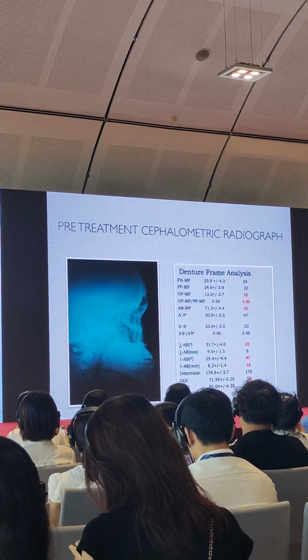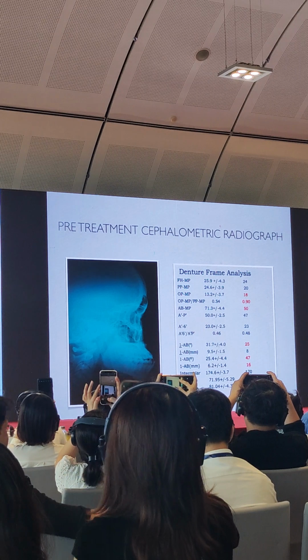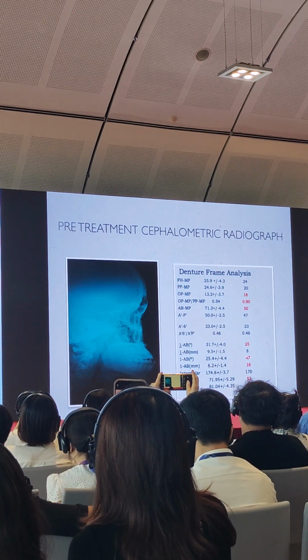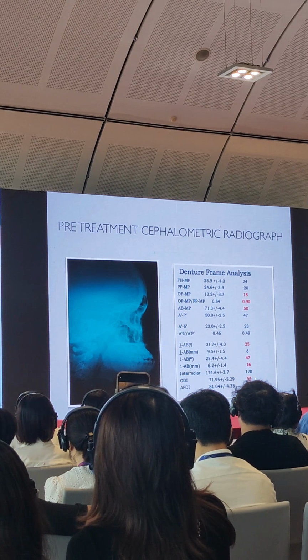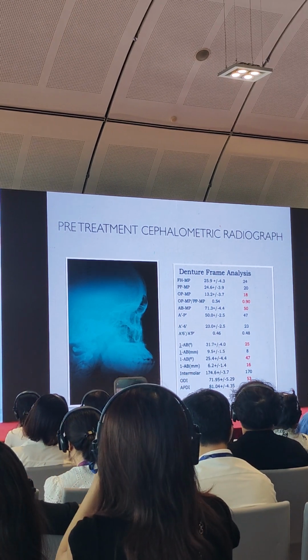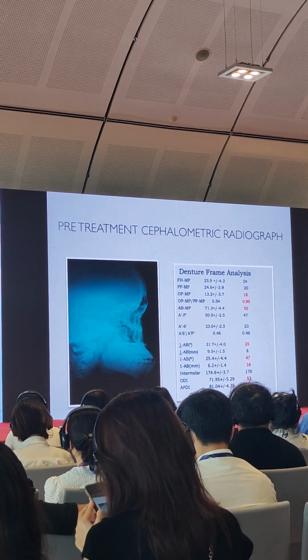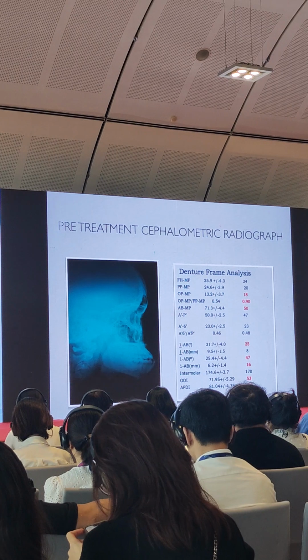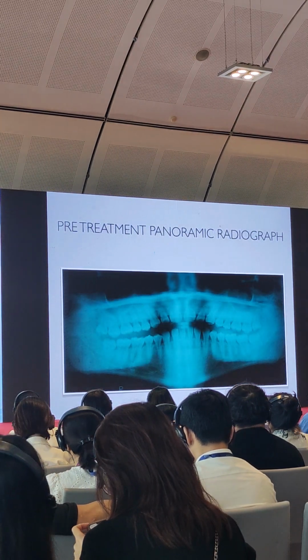Cephalometric would show you a very flat occlusal plane. The teeth on the upper and also on the lower are very flared. You get an open bite because it's 53, and it's 101, which is a skeletal class 3 pattern. So this is the panoramic view.